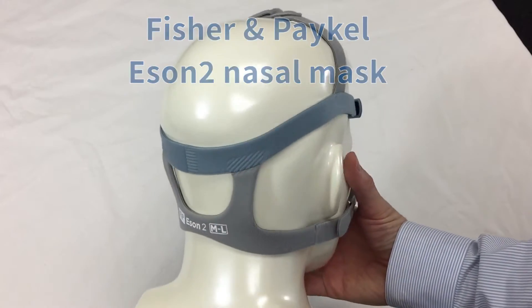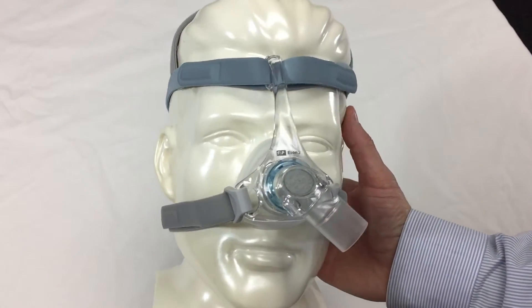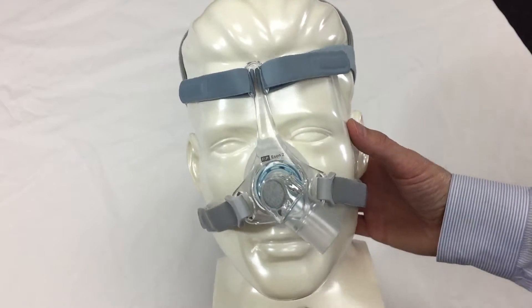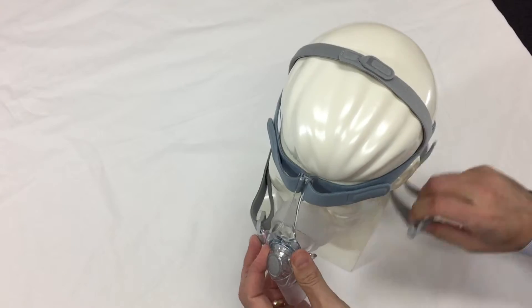This is an improved version on their original, which was just called the Eson, and this one is called the Eson 2. I'll give you a 360 view of the mask, and we'll take that off to give you a closer look.